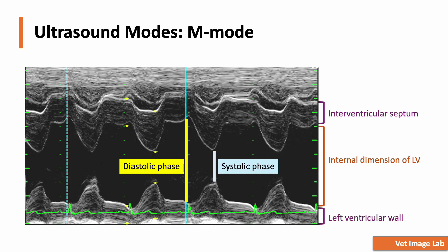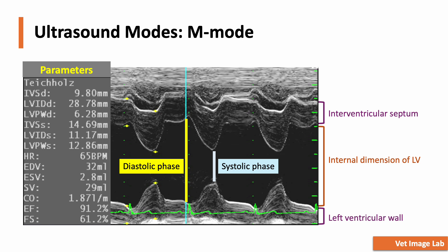Here we have an example of an M-mode image captured by placing the M-mode cursor through the left ventricle at the level of the papillary muscles. With this, we can track the movement of the interventricular septum, the left ventricular internal dimension, and the left ventricular wall over time. It's divided into two phases: during diastole, marked by the yellow line, the left ventricle relaxes and fully expands, allowing blood to fill the chamber. Then during systole, indicated by the blue line, the left ventricle contracts, reducing its internal dimension as it pumps blood out. Key measurements include the thickness of the interventricular septum, the left ventricular wall, and the left ventricular internal dimension — helping us detect abnormalities like hypertrophy, dilation, or impaired contraction.